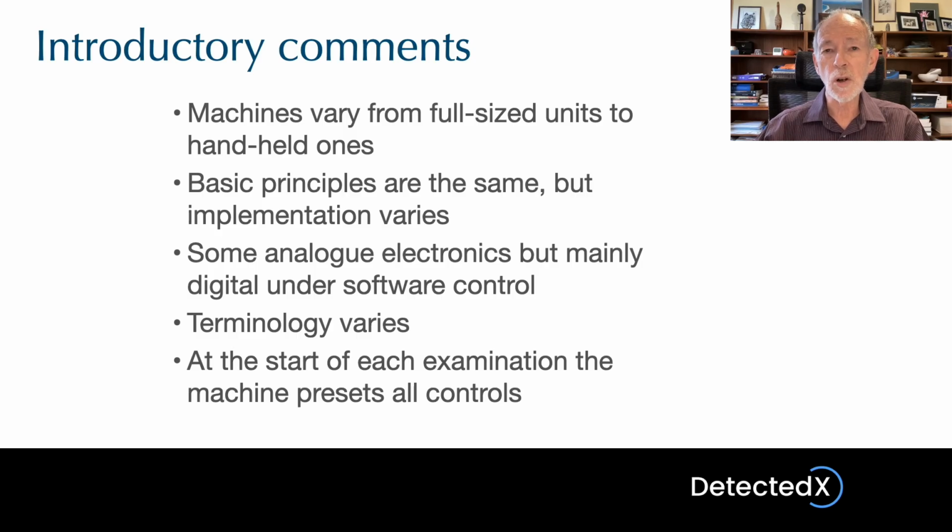Whenever you interact with controls, that's interpreted by the software, and appropriate commands are sent to the various processing modules to respond to your changes of the controls. Another point I'd like to make about ultrasound is that you will find variations in terminology. I try to use generic terminology as far as possible, but even that is a little variable. Many companies have come up with their own names for particular functions. So you'll probably find that you'll learn to do some translation from the generic terms to the particular corporate terms used by different manufacturers.